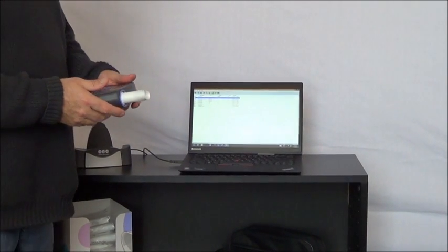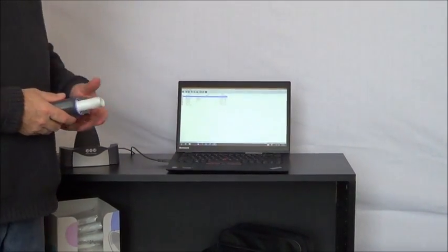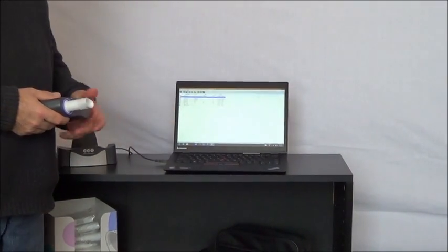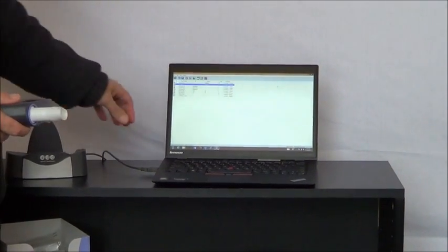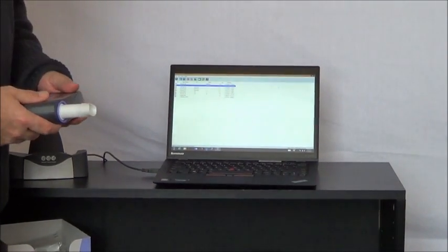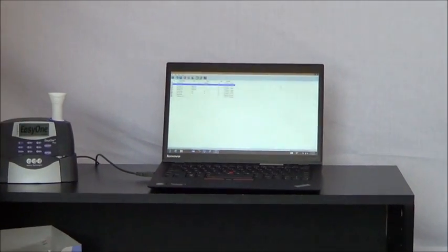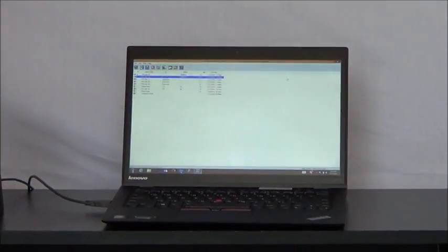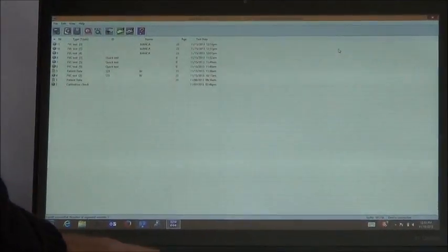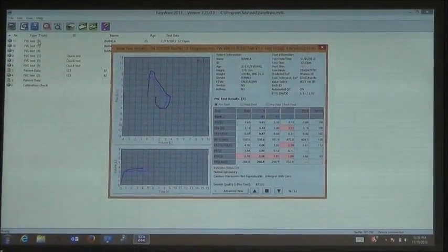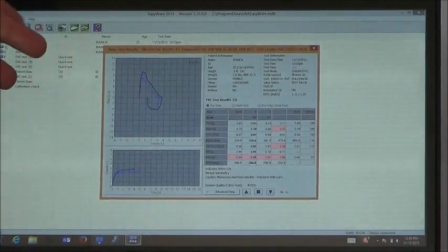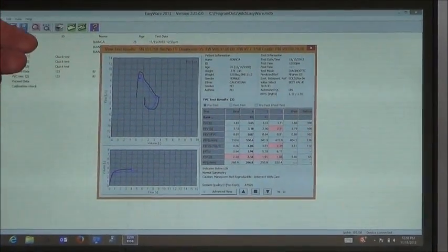Another option with the Easy One is to download the data into a PC running our PC software called EasyWare. Here I've got the cradle connected to the PC, and I connect the device to the cradle — the test will download into the PC. Once it's in the PC, EasyWare allows you to view the data, turn data, print data, and easily make PDF tests as well.